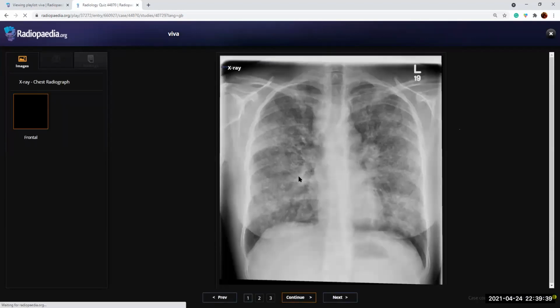Then did we, I think we started from this one, no? Yes. Yeah, so this was a classical case of sarcoidosis. You got it, you put it as your last differential because you picked the lymph node, it should have been your first differential. That's the only thing. Otherwise, it's all fine. Thank you so much.